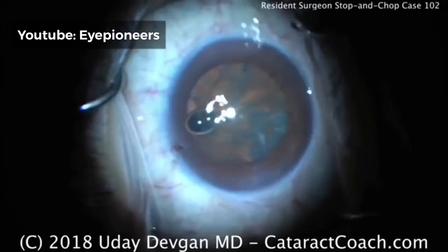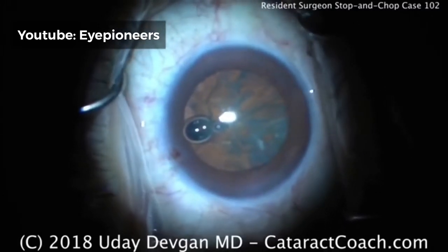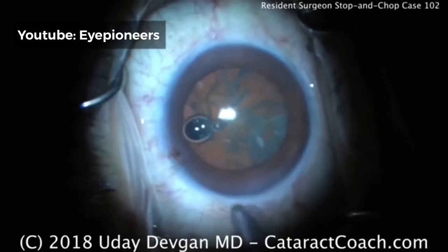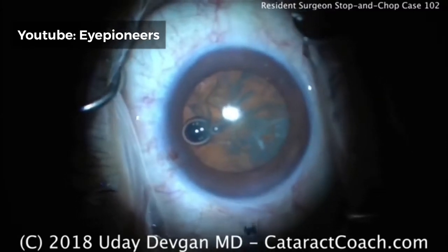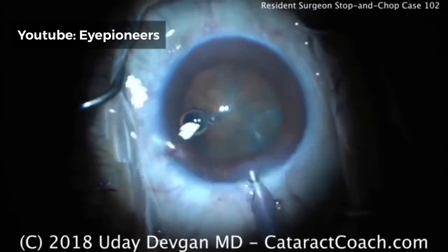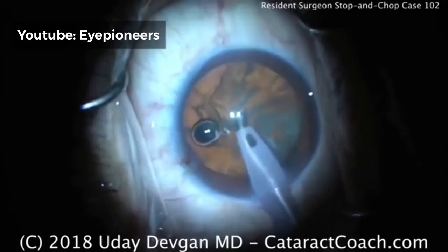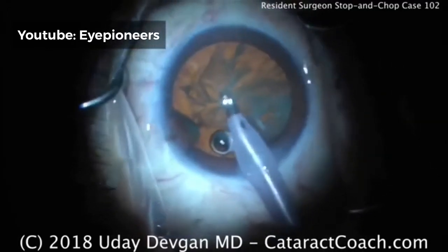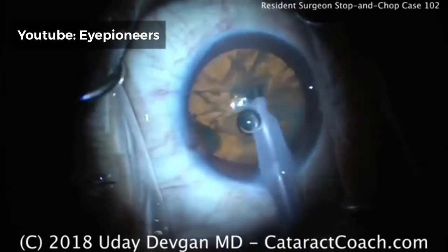The resident has decided to do a stop and chop technique for this surgery. Adjusting the phaco probe — this first setting will be more of a sculpt setting: moderate power, low vacuum, low flow. You don't need to vacuum a lot of material away or run a lot of fluid through the eye; it's primarily using the energy to sculpt that groove. Taking out the air bubble, which also removes whatever little viscoelastic is left. Bevel up on the phaco probe, cleaning up a little bit of the anterior cortex.